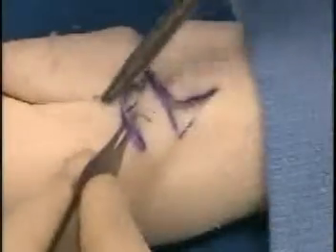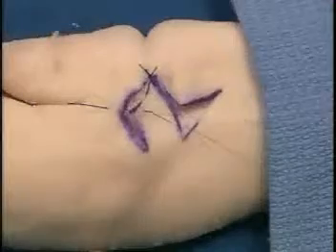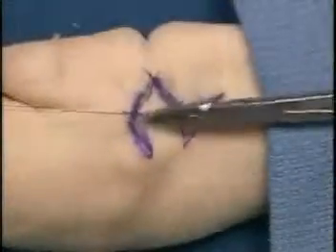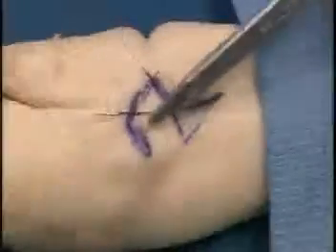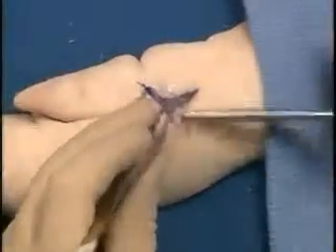Now the second suture is placed again at the apex of the flap, and again it's possible to use a corner stitch if you wish, but in this particular example we use just a direct interrupted suture technique. And the third apex is now approximated.